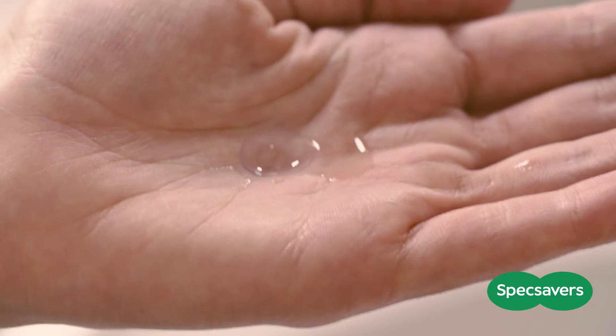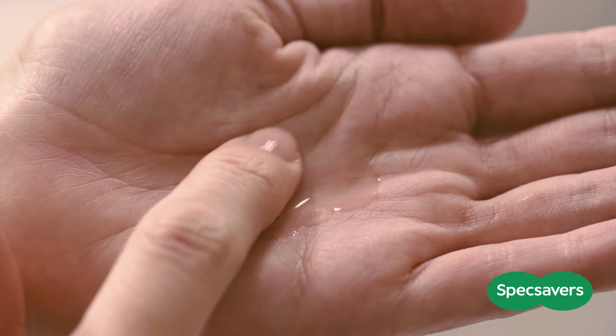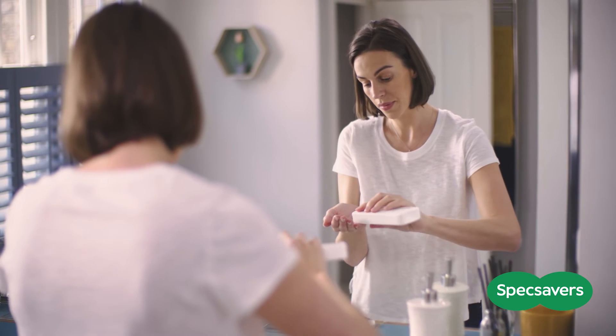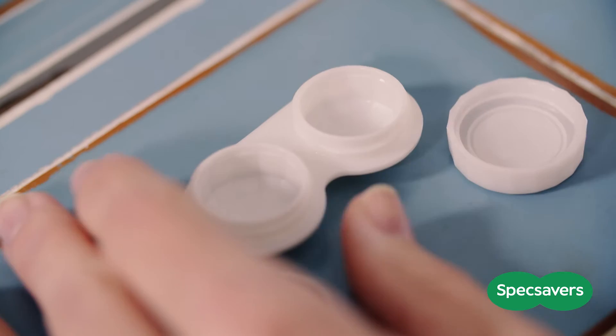To clean your lens, put a few drops of solution on it and rub gently from side to side for about 20 seconds. Once you've finished, put a few more drops of solution onto the lens to rinse it.